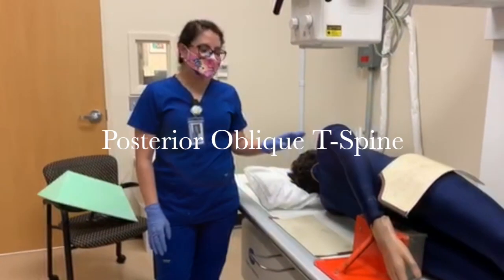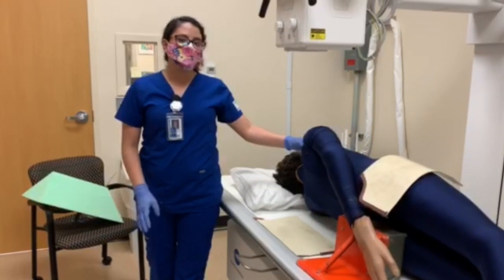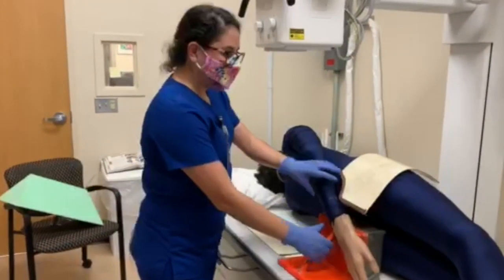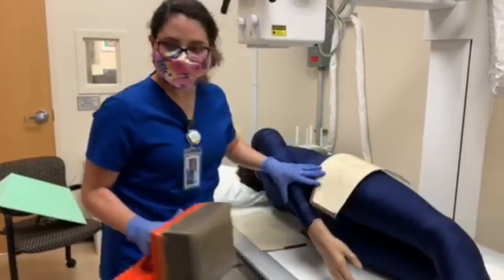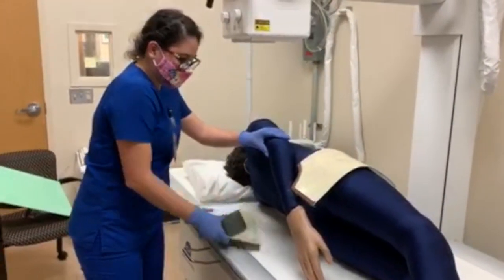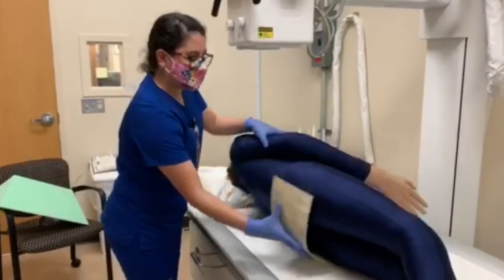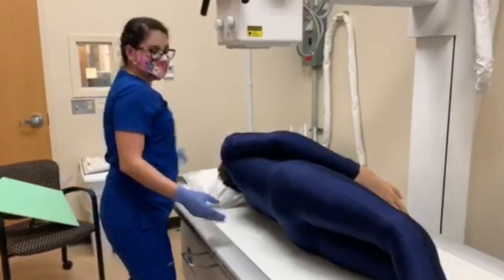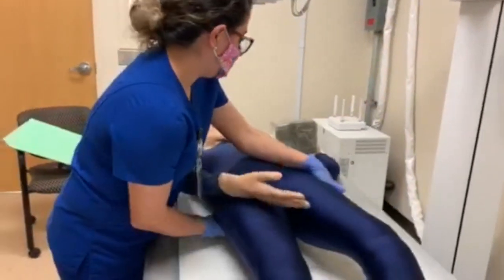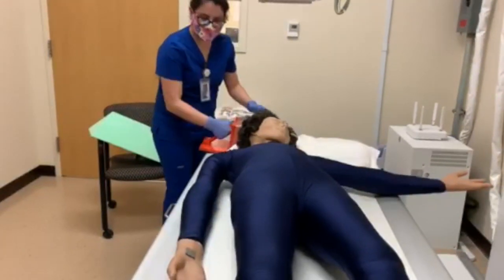So continuing off of what Drea did, we've already got the patient in a lateral position on the left side. Now we're going to get her into a position on the right side to do her entry. I'm going to remove the weight. Remove the sponge and the extra leg. And we're going to roll it back. Move this out of the way.